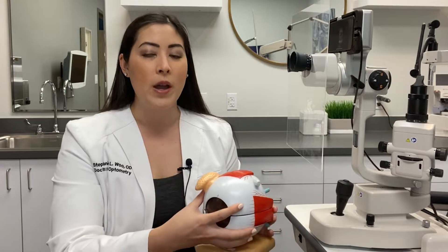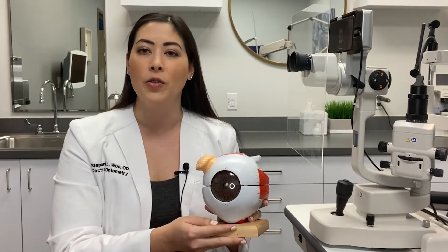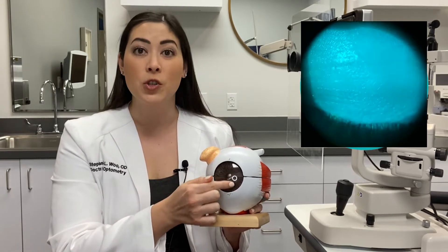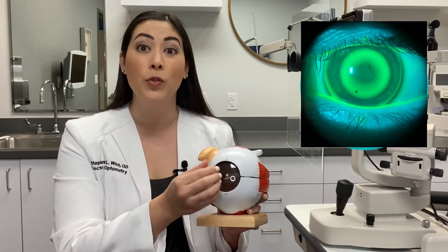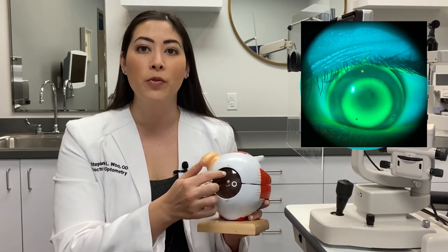So let's talk about how it works. With orthokeratology you have to take some special measurements of the front surface of the eye called the cornea. What's happening is when you put the contact lens on it's flattening the surface in the very center of the cornea, and it's using special forces to move liquid or fluid into different layers of the epithelium in the peripheral cornea.